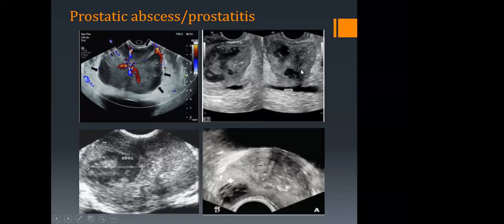of abscesses. From the clinical perspective of abscesses, you will mostly get fevers. So consider your clinical presentation of the patient too. We have another appearance here. Maybe something I have to mention here. You can see I have inverted my images now. Image orientation is individual based. Orient your image to the easiest way you can interpret them. You can have this and you provide your pathology there.